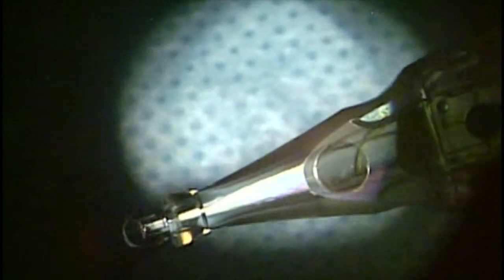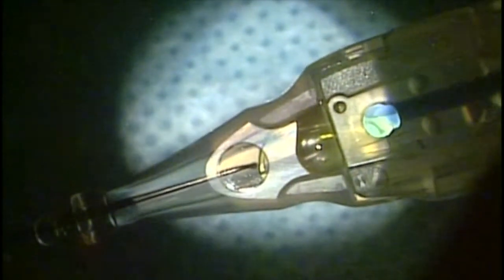Here we can see that that leading haptic is not catching on the side wall of the cartridge and it's going to become straight. So what you can do is simply put your second instrument inside of the eye and block the path of the leading haptic from going forward while at the same time depressing the device so that the lens moves forward.